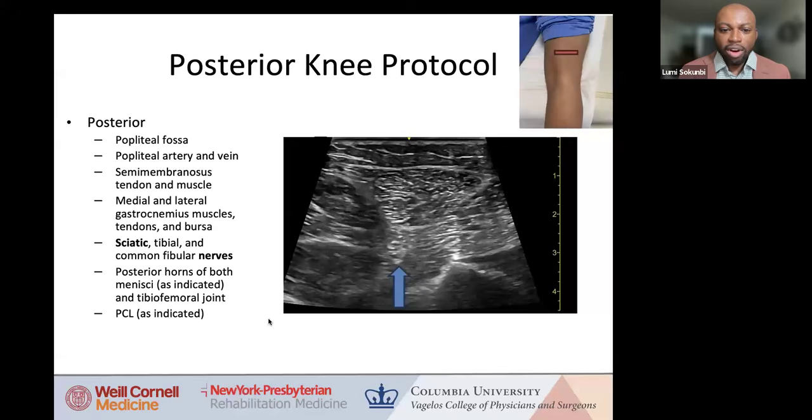So next up, we have some significant nerves in this region. There is variability in where the sciatic nerve divides. So starting off in a transverse orientation in the mid-distal thigh with appropriate depth, and making sure you do dynamic scanning so you can evaluate things completely. At the apex of that popliteal space, the sciatic nerve splits into the tibial and common peroneal nerves.